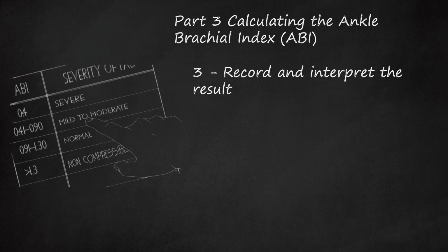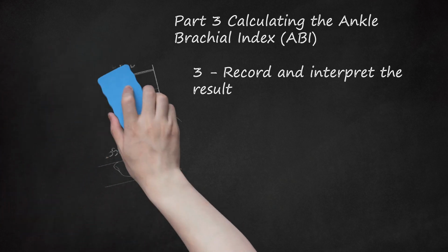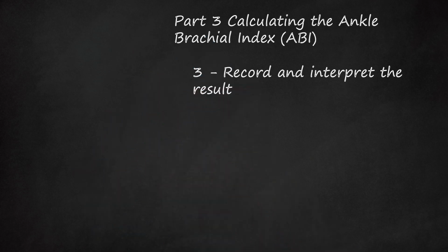An ABI of 0.41 to 0.90 indicates mild to moderate peripheral artery disease and warrants further tests like CT, MRI, or angiography. An ABI of 0.91 to 1.30 indicates normal vessels. However, a value between 0.9 and 0.99 may cause pain during exercise. An ABI greater than 1.3 indicates non-compressible and severely calcified vessels that artificially raise the blood pressure. Long-standing diabetes or chronic kidney disease may lead to this state.